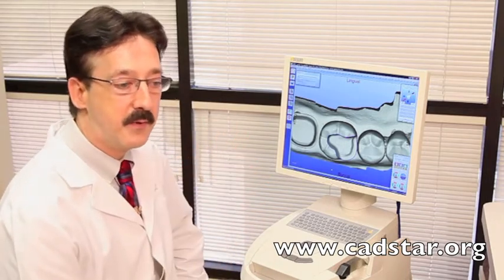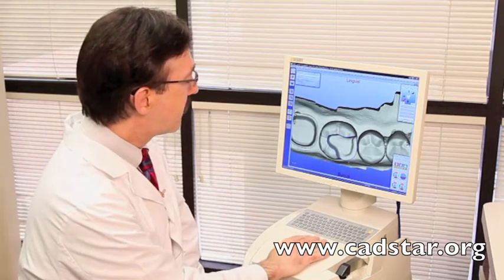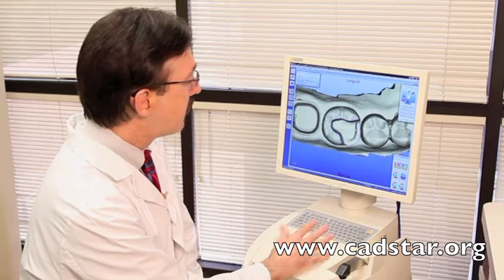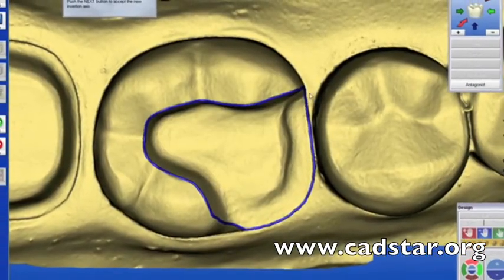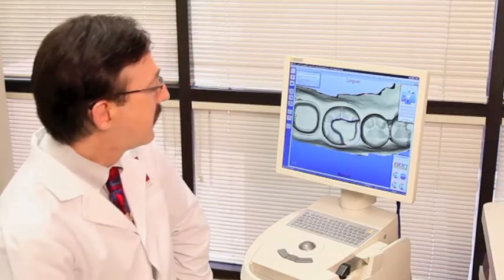If you do that before you give the information to the computer, the computer is going to give you a great restoration in its design. We'll set our draw by setting it three-dimensionally — I want to be able to look right down under the prep and down the surface of my interproximal contact of the second premolar. We'll use the next arrow button.